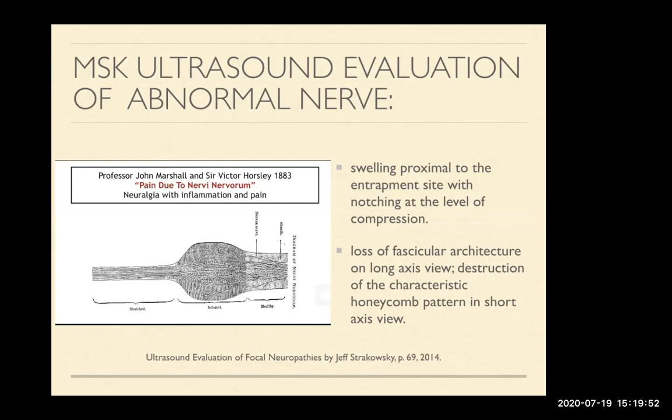Okay. Sometimes one nerve may not really be bigger than the rest, but they kind of diffuse or bridge together, then that could also be an indication that that particular nerve has a problem as well.